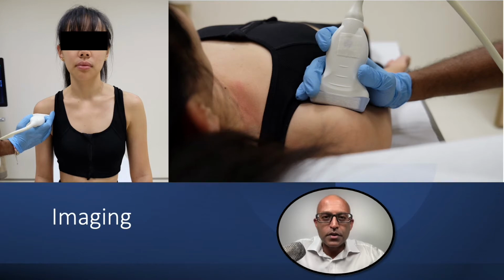On the left here, you see a similar positioning to the ESSR guidelines, with the subject upright and the hand in a supinated position with the transducer across the biceps tendon. An alternative is to have the subject lying on the examination couch in a supine position.